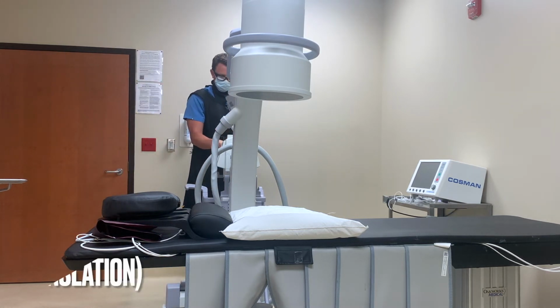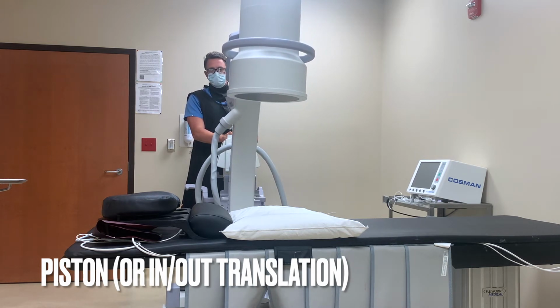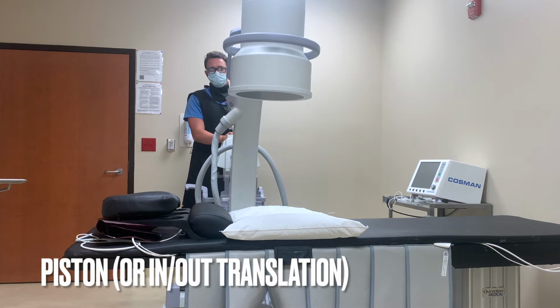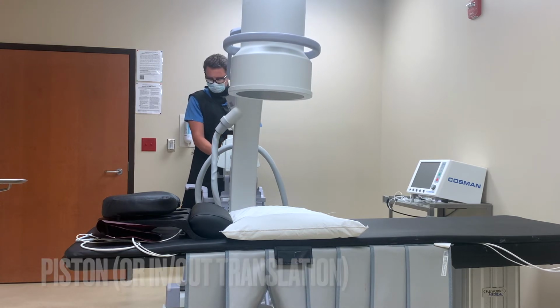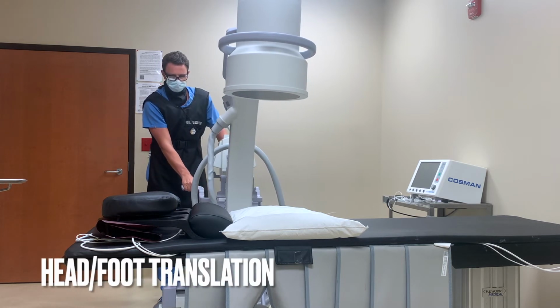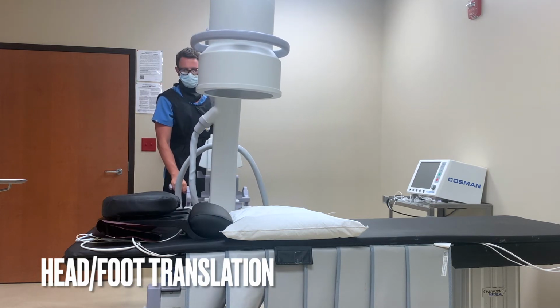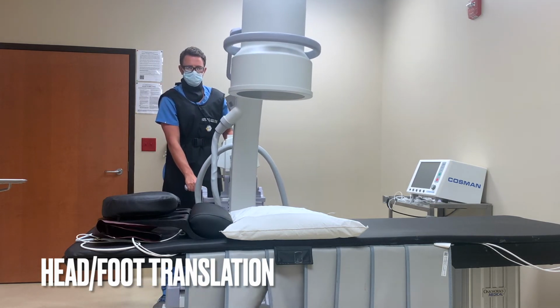The next movement we will display is the piston, also known as in or out translation. This is when the C-arm translates towards the patient's right or left. Next, we are going to do a head or foot translation. This is when the C-arm moves parallel to the patient, either superiorly towards the head or inferiorly towards the feet.